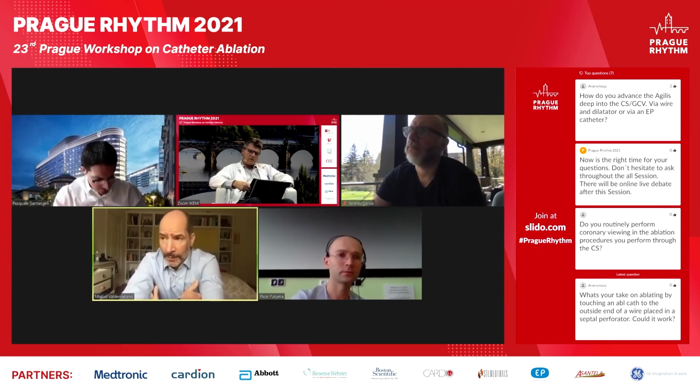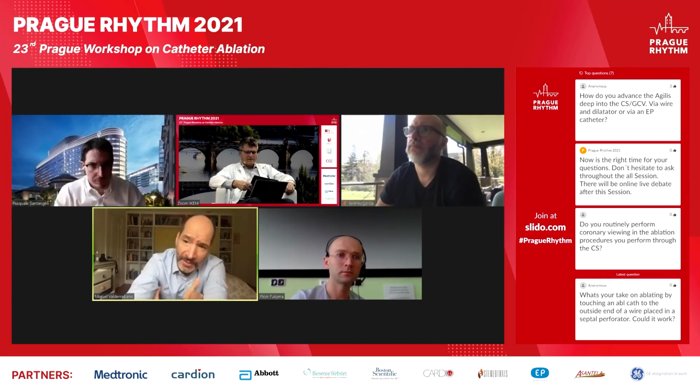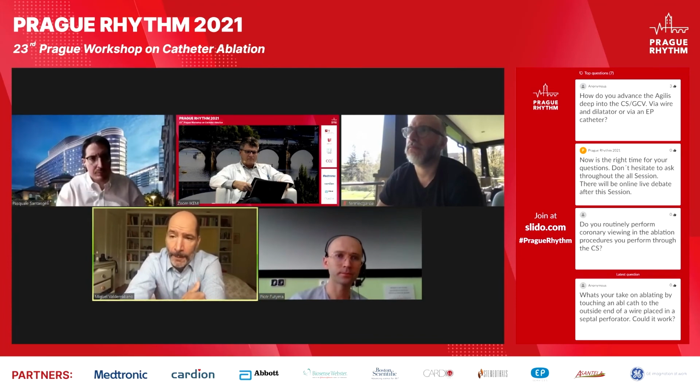And the double balloon, in my experience, has allowed us to be more flexible. It's very interesting that the first time I delivered double balloon was in an ischemic VT years ago, 2015. But then the first time I actually delivered double balloon was in Prague a few years ago. We had a very big septal. We got a beautiful signal in the middle of it, but then distal in that septal there were huge branches, so we blocked. And we got success. Then the PVCs came back. Then we reinforced with radio frequency. It's kind of a game here, so not always is it perfect. But for the most part, if you get a good signal, I deliver alcohol.